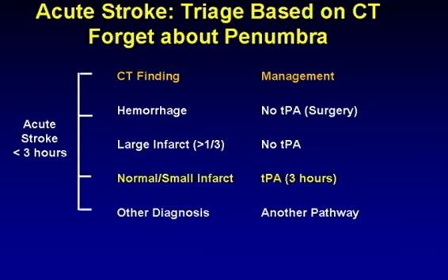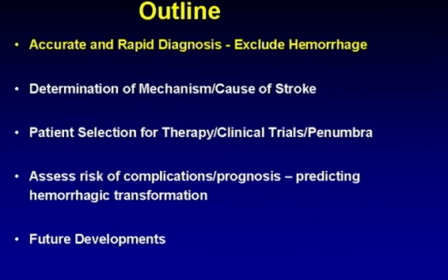Non-contrast CT, triage the patient. If there's hemorrhage or large infarct, no TPA. Okay, I can probably finish there now and go home, but I have to fill in another 35 minutes. So the rest of the talk, we're going to talk about some of these other headings.